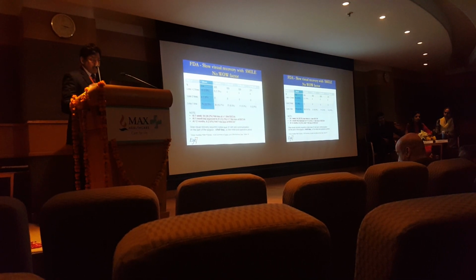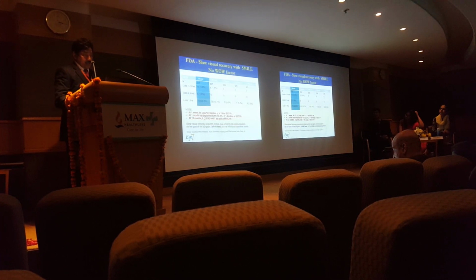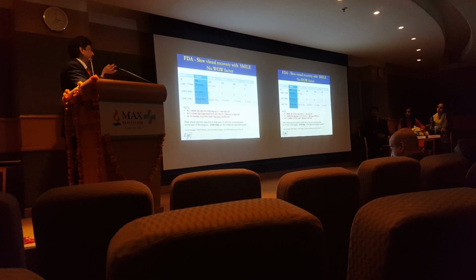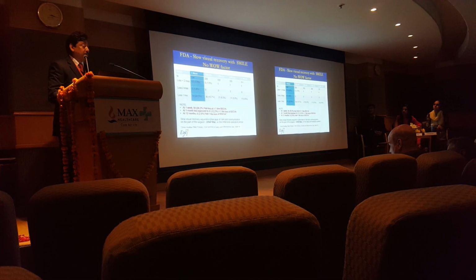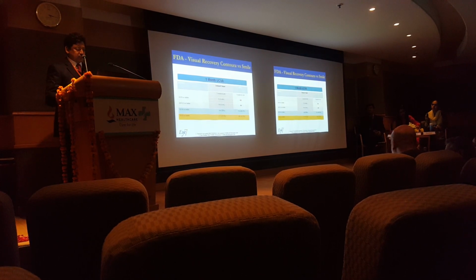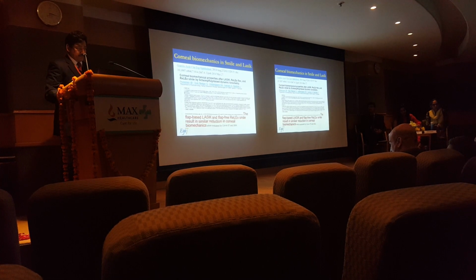Okay. At 1 month, it improved, but still 41 patients had that loss of one line. And at 12 months, 8 patients still had loss of one line. That means even at 1 year, there were 8 people in the study who did not develop 6/6, but they did not even have 6/9. That is SMILE, which has never happened in Contoura. So if you talk about visual recovery and compare Contoura and SMILE, if you look at these scores, Contoura is about 10% better than SMILE in terms of visual recovery.